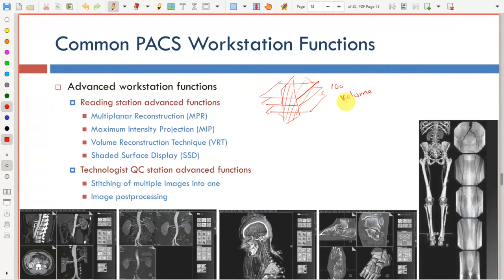This is not volumetric imaging. It's not going to show you a volume, but it allows you to slice through the volume and get an image in any direction you want. This can be very important because some of the structures that you are interested in might be in between images, or might be distributed through multiple of the original images. So might be here and here and here.